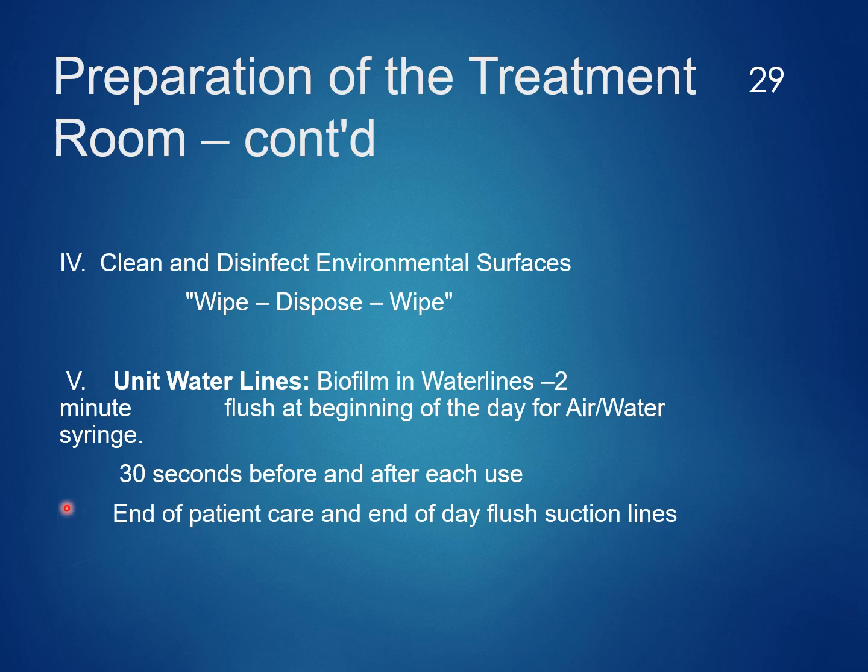Then in between patients, we'll do it 30 seconds before and 30 seconds after each use throughout the day. And then at the end of our patient care, whether you see a patient in the morning or during the day, we always are going to flush our suction lines, those evacuation lines, especially the low-level suctions or the high vacuum suction. And then we're also going to flush that at the end of the day as well to prevent bacterial accumulation.